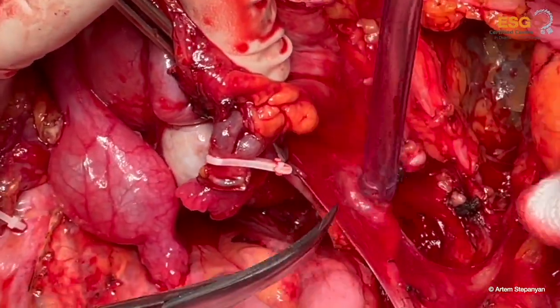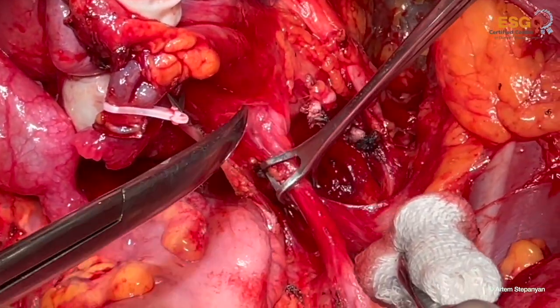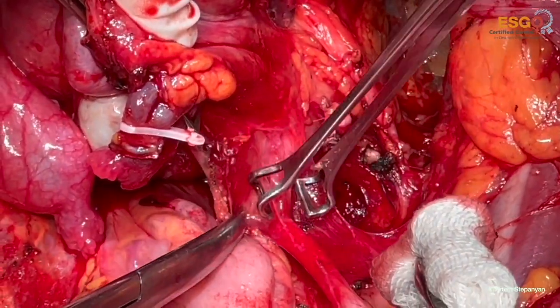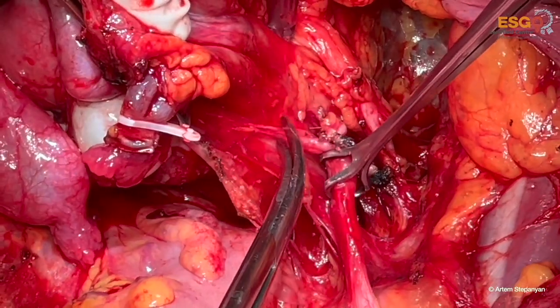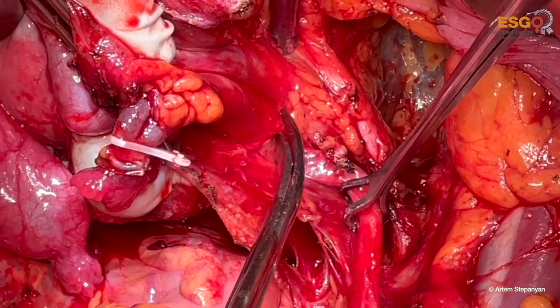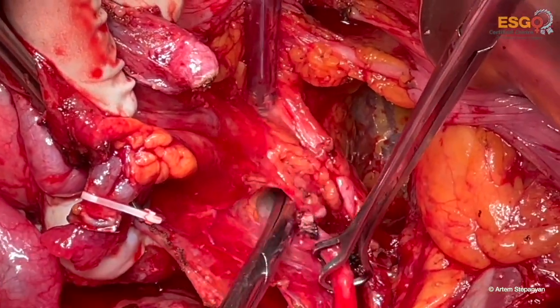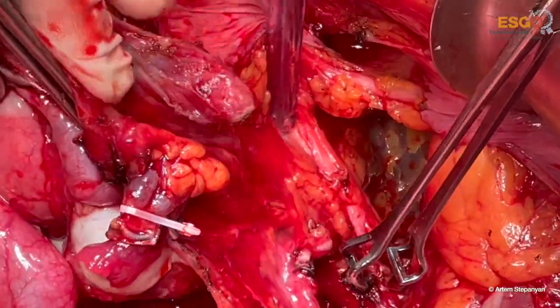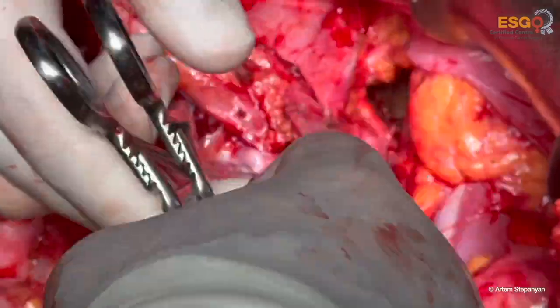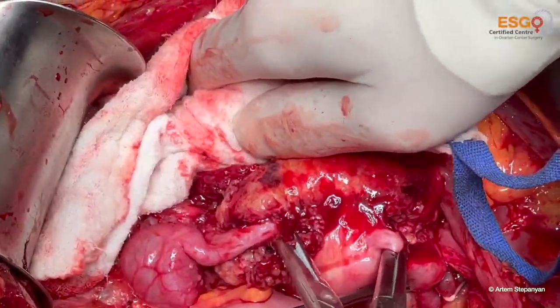For ureteral dissection, we usually use cold scissors, trying to avoid both monopolar and bipolar cautery, to avoid the thermal damage and strictures of the ureters in the postoperative period.